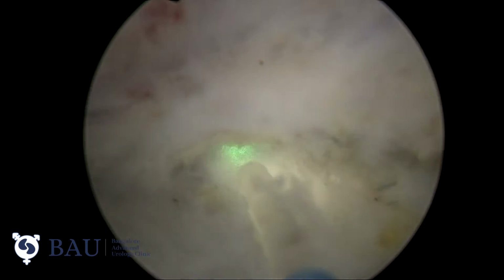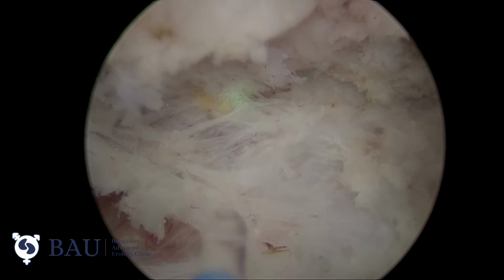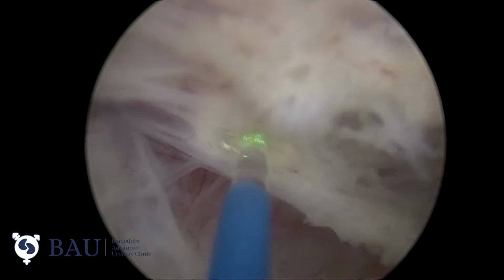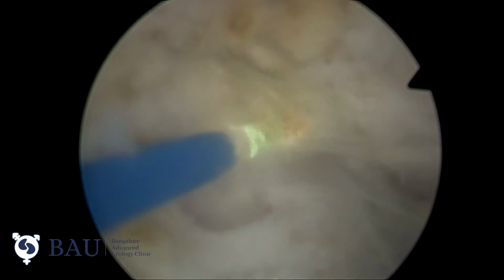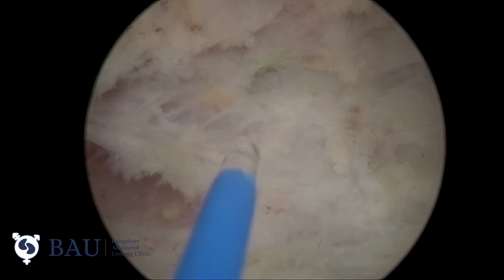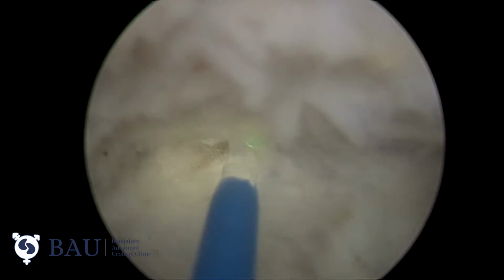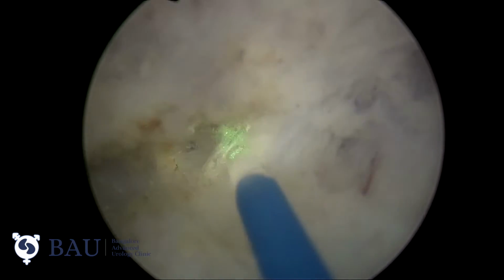Always try to be next to the prostate lobe rather than towards the capsule. Sometimes we may enter into a false plane outside the capsule, so be near to the gland. That will prevent perforations in the capsule.